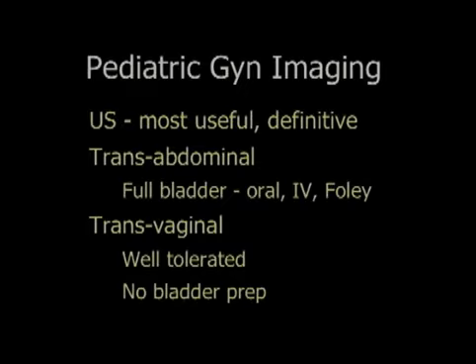Most of the time we're doing transabdominal images, so you need a full urinary bladder, whether you do that with oral hydration, IV hydration, or putting a Foley catheter and retrograde filling. Depends upon how soon the information is needed and how well your patient can tolerate having a full bladder.